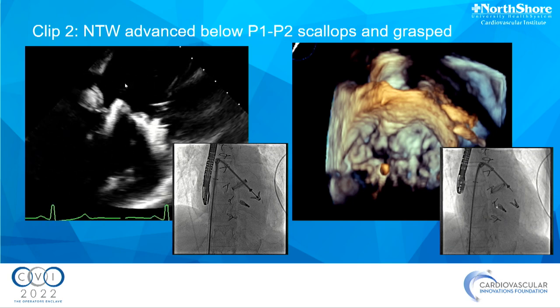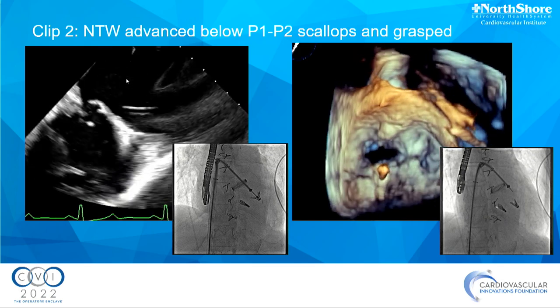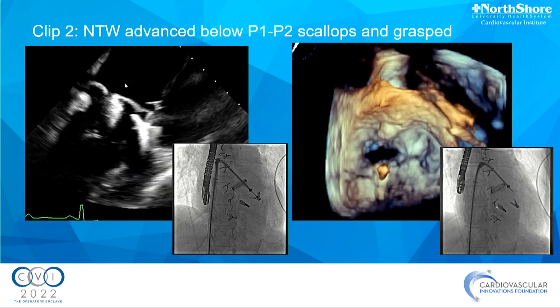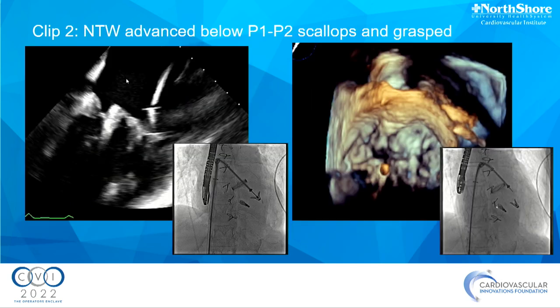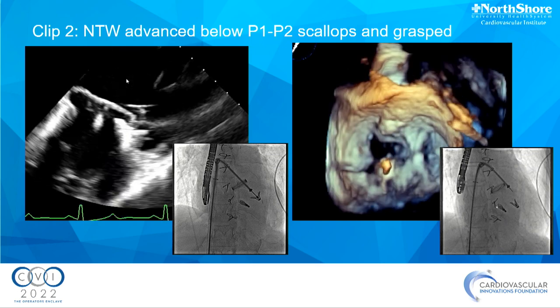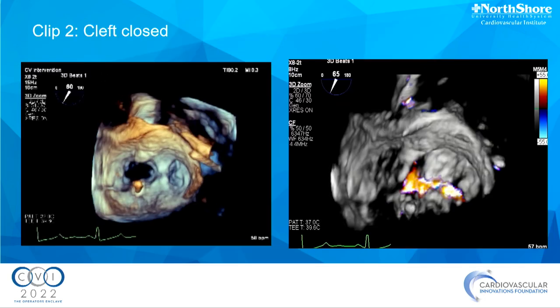As shown on the right. And actually, if you could make that right color panel play, beautiful. You get a pretty good look at that. Close the clip arms. Go back, please. Thank you. Close those clip arms down. Not fully. I just decided that maybe I should close this thing to just 20 or 30 degrees, because we're in a funny spot.